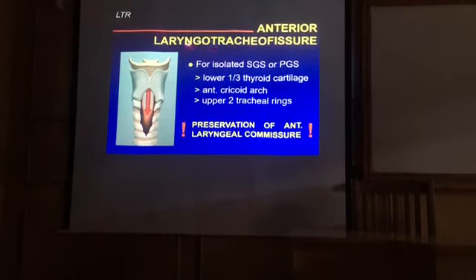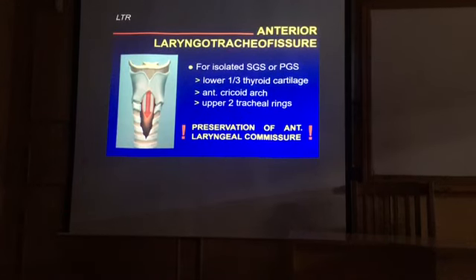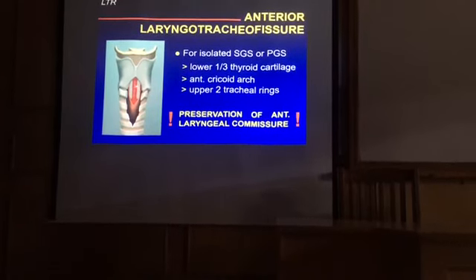If we do a laryngotracheal reconstruction for a purely glottic problem, so it means posterior glottic stenosis, but the subglottis is fully normal, we never transect completely the laryngofissure here. We make an inferior midline laryngofissure up to the level of the vocal cord, the anterior commissure here, and I remind you that the vocal cords are inserted at mid-distance from the thyroid notch to the inferior margin of the thyroid cartilage, excuse me.